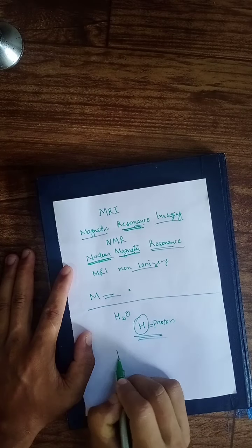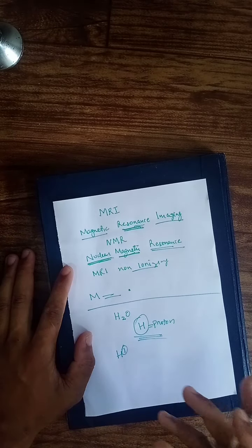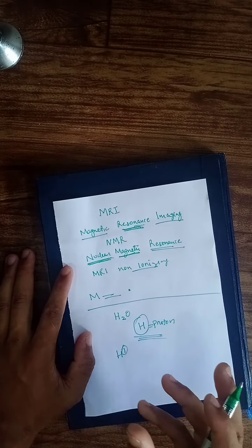We know that the atomic number of hydrogen is 1, right? Whatever element you take, it should have a lone electron at the end. If you take lithium, the atomic number is 3. By now you must know about electronic configuration.